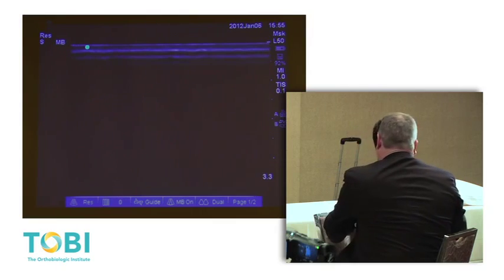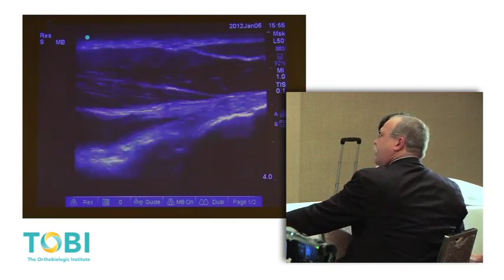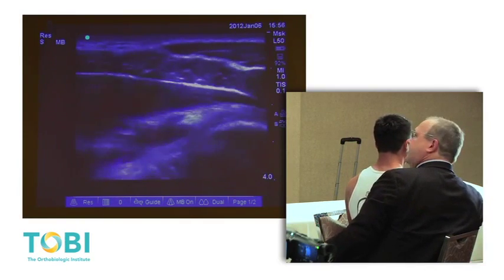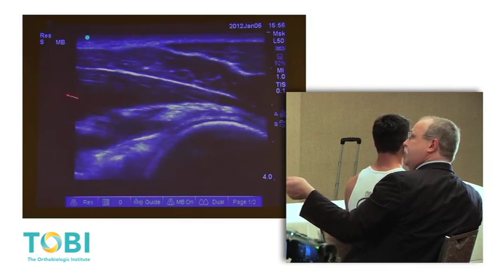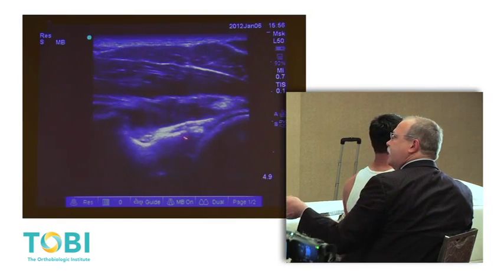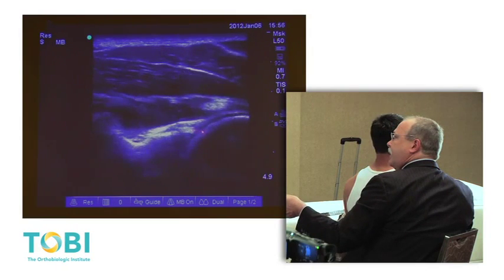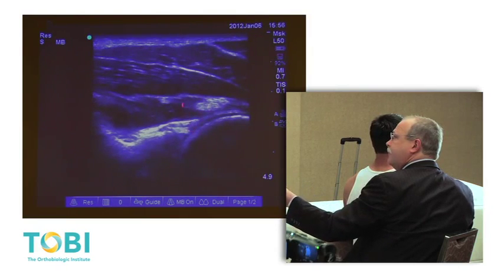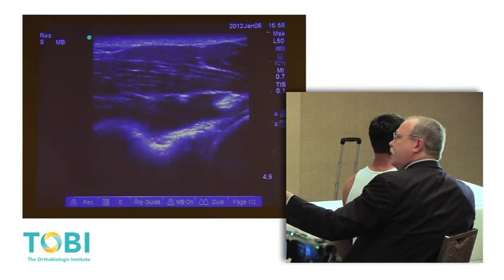Posterior aspect of the shoulder would be the last thing that we'd look at. They need a little more depth here. Have the patient bring his arm across his tummy. Humeral head, articular cartilage. So this is lateral, this is medial. A little more depth so that we can see the brightly echoic posterior labrum. So again, needle placement from a lateral approach would come this way and be placed right here. And then the spinoglenoid notch right here.